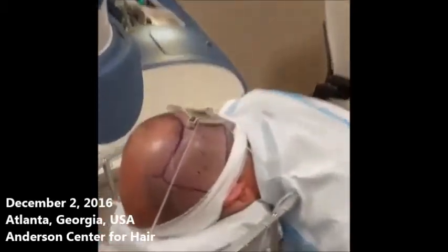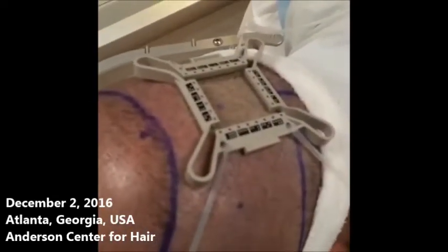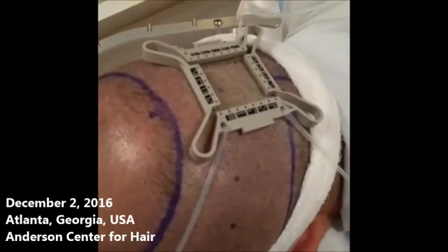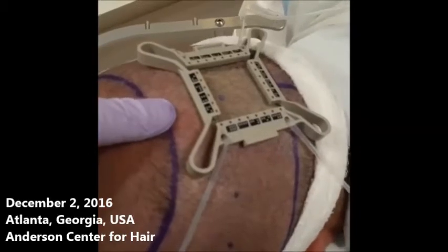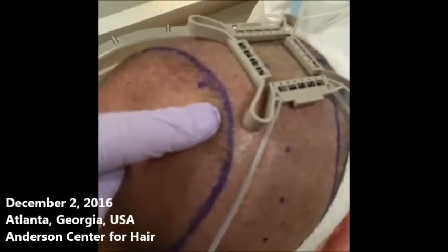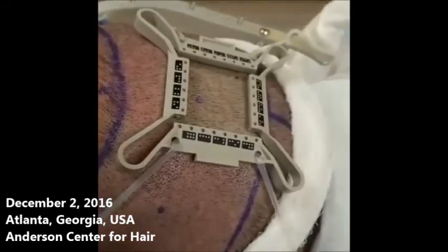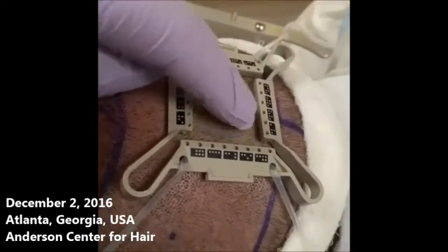I'm going to show you a bit about the color, just like yesterday. You can see that the skin outside the tensioner blanches in color — it's nice and pink, and when I press on it there's a little white spot. The skin inside the tensioner is a lighter color than the skin outside because of all the tension.